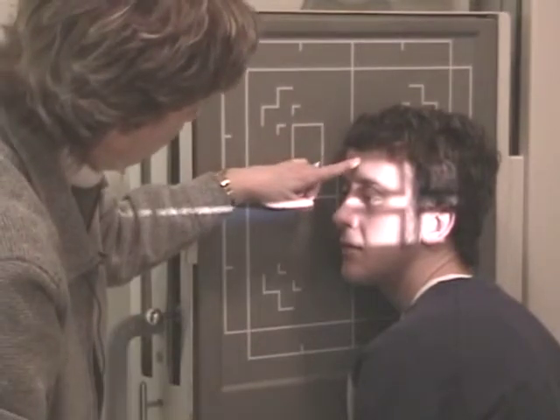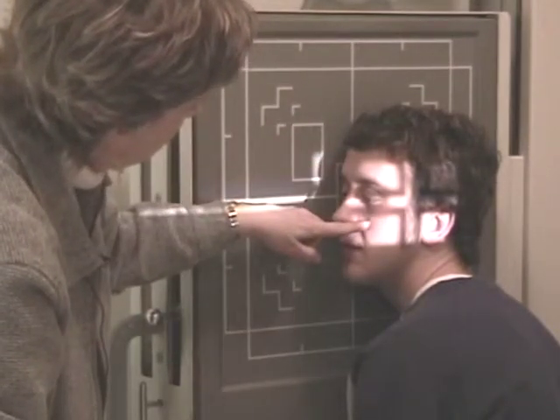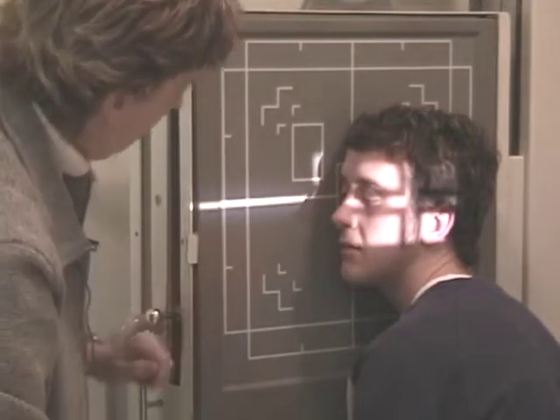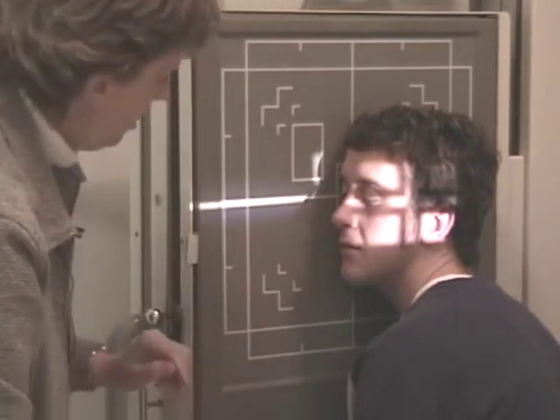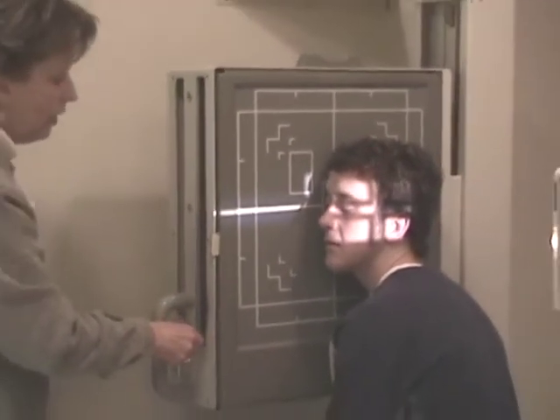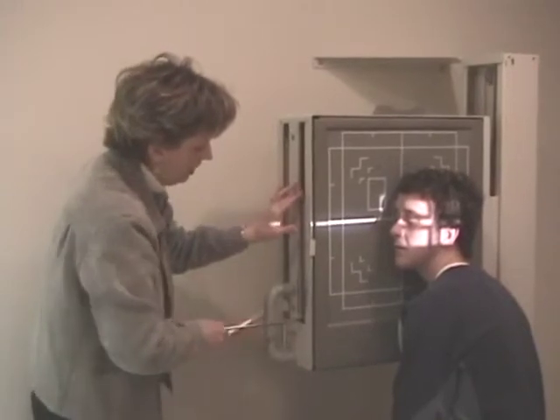Frontal sinuses will be here, maxillary sinuses there, sphenoids in a little deeper, ethmoids in a little deeper. And this projection is good for all of the sinuses. It's the best one to demonstrate each of the sinus cavities.